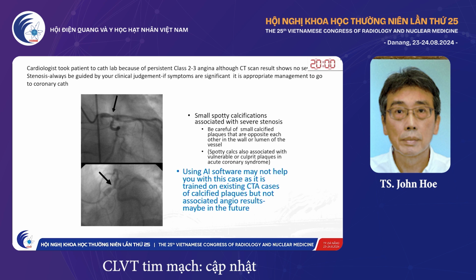They can cause partial volume artifacts and we can miss it. I'm not sure, again, using AI software may help you, as it's usually trained on existing CTA scans, but not with associated cath lab results, perhaps in the future. But I think AI would miss this.